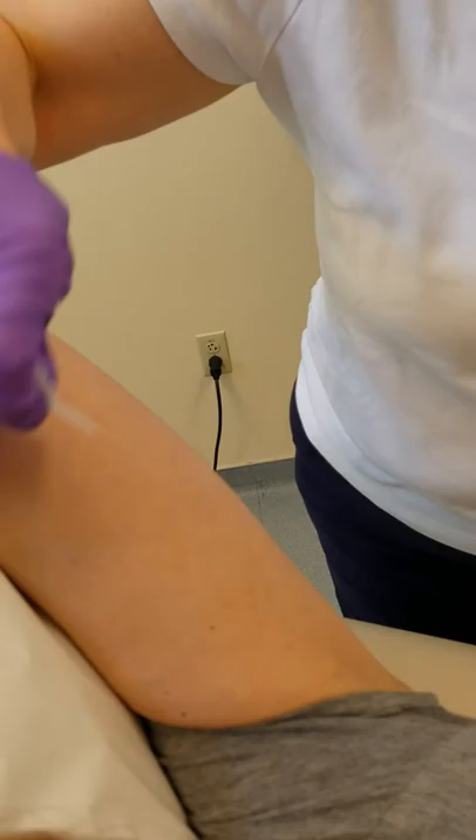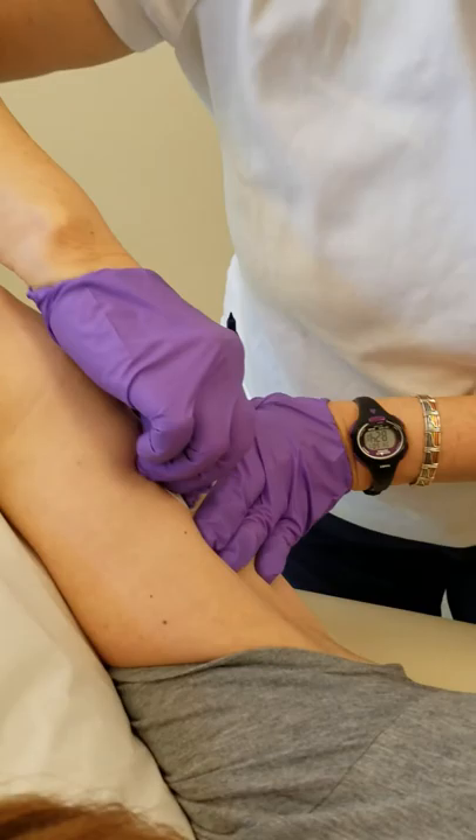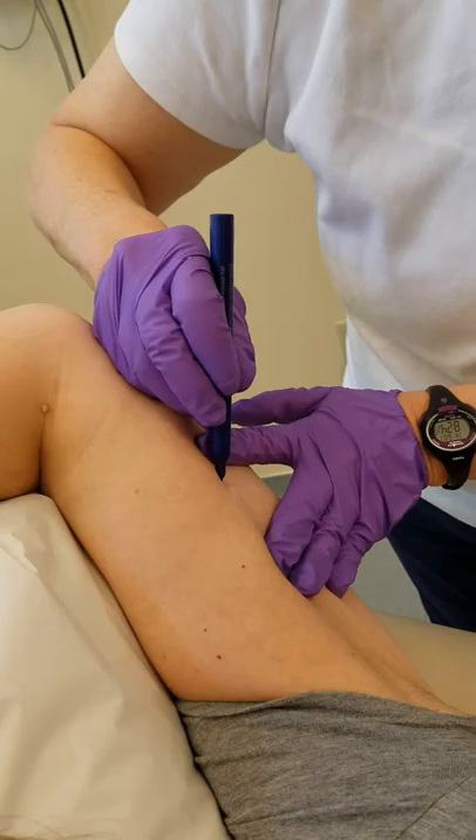What we're doing here is removing a Nexplanon. What I've noticed over time is that these can get to be a little adventurous — they tend to want to slip and we tend to go digging for them. They're in the subcutaneous and it's a slippery area. So I've developed a new technique that seems to work a little bit better.